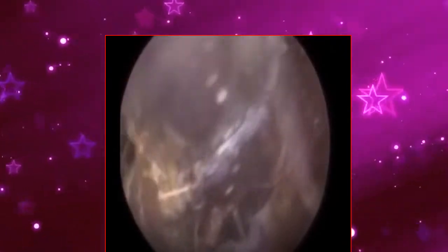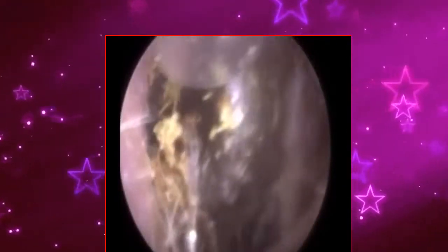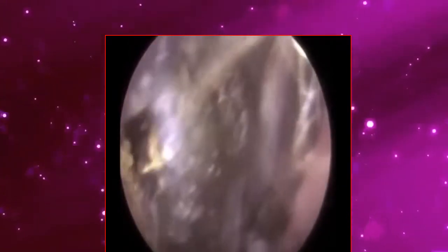So this patient previously had that, and they had it removed, and it's caused an enlarged cavity. And actually this piece of wax was lodged. So I've not focused too much on the actual procedure, but it will become very apparent in a moment when I remove this wax what I'm referring to.